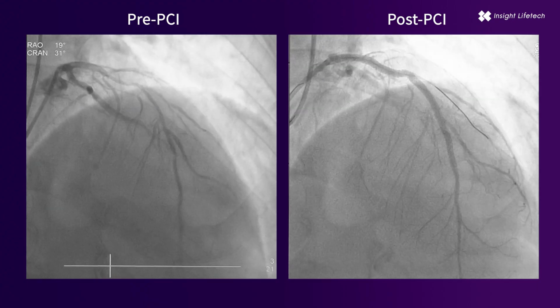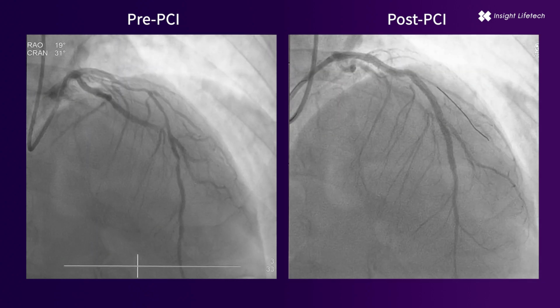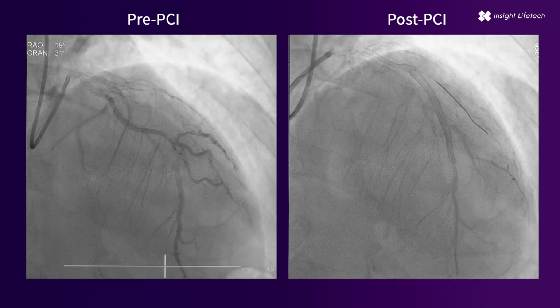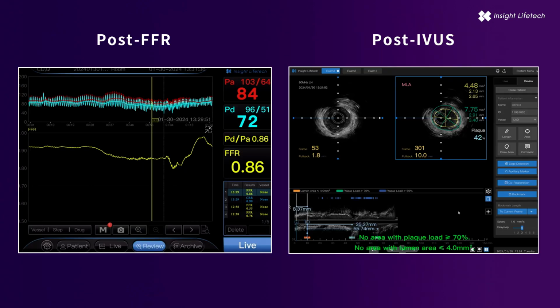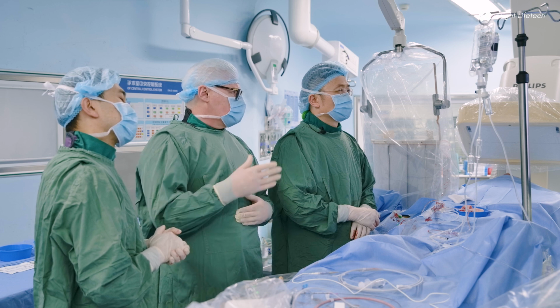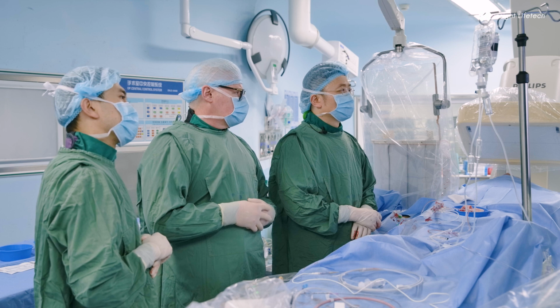Okay, Professor Jun, we can assess this as a very good result by angiography, but what is even more important, in the beginning there were some discrepancies in physiology assessment with the pullback, because there was almost no gradient in the mid part of LAD and very severe gradient in the proximal part. But with IVUS we confirmed there were angiographically tight stenosis and a lot of diffuse disease.